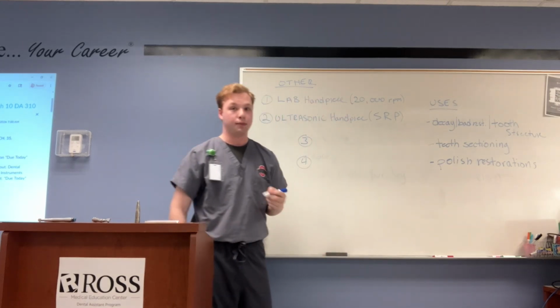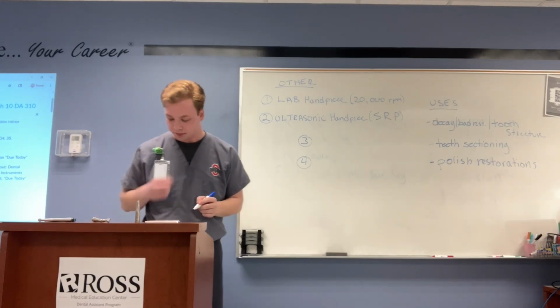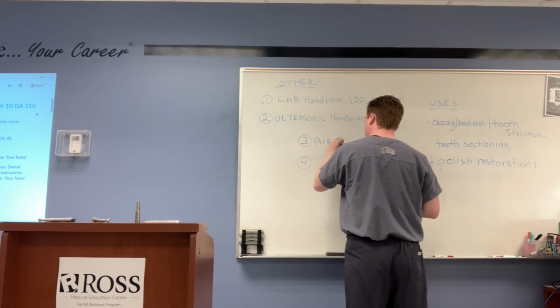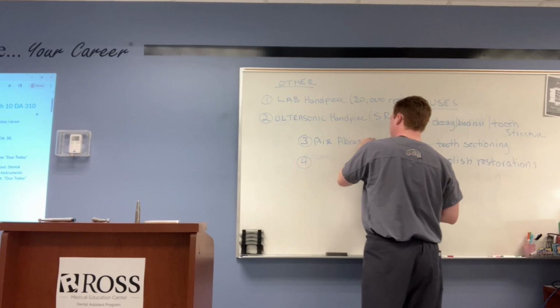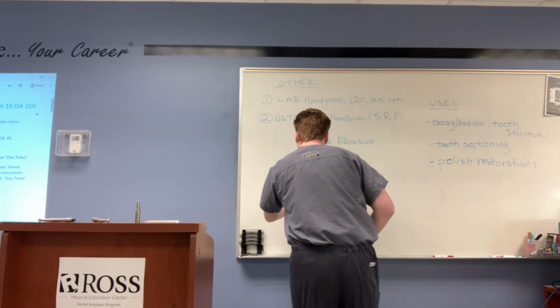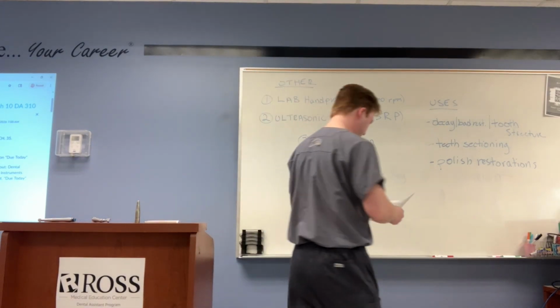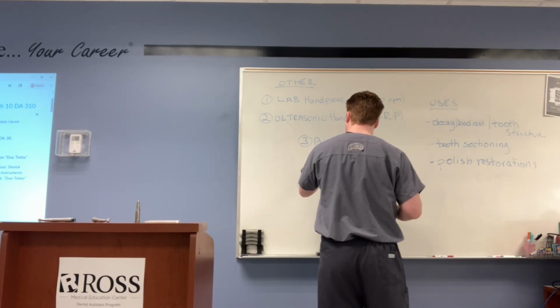You might see an air abrasion handpiece. Air abrasion. It's basically a small version of a sandblaster. What I want you to know about this is, again, it's a small version of a sandblaster. So I'm gonna write sandblaster in parentheses.